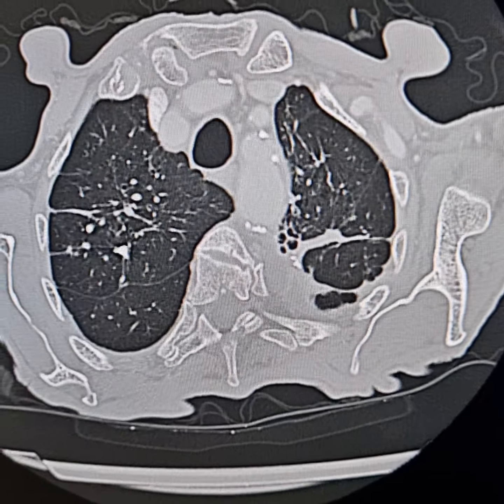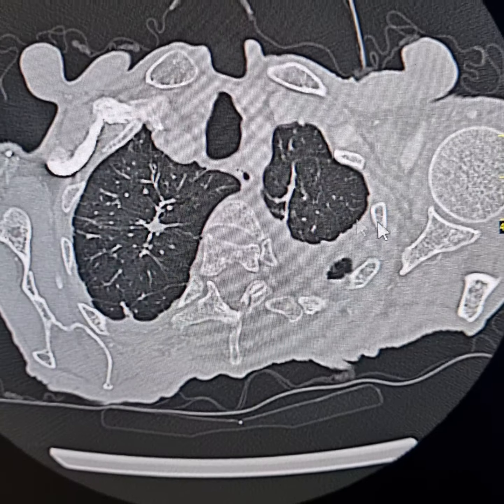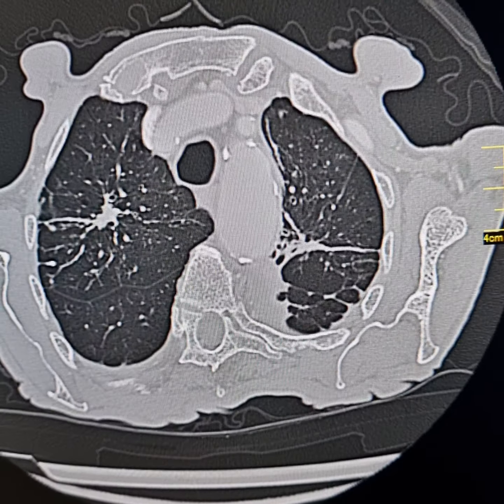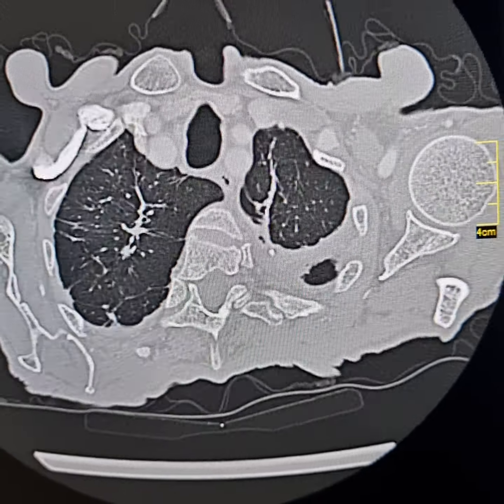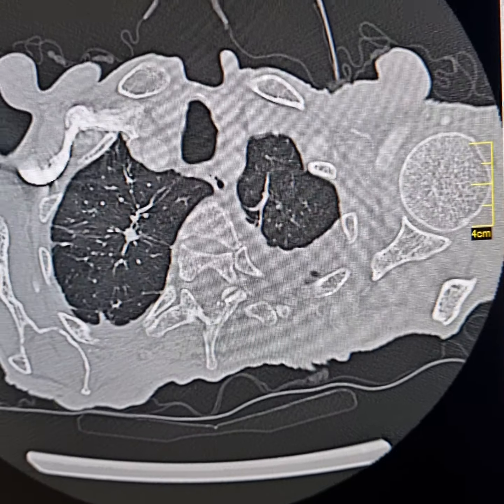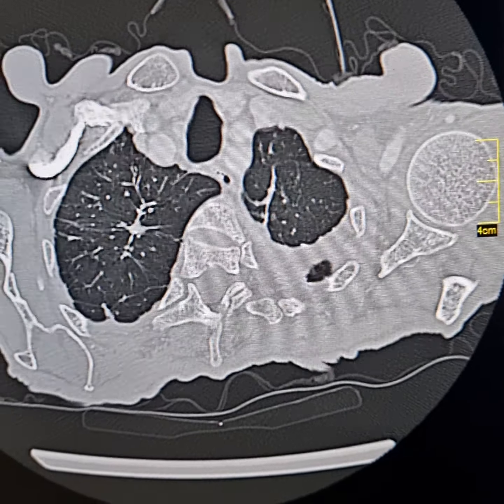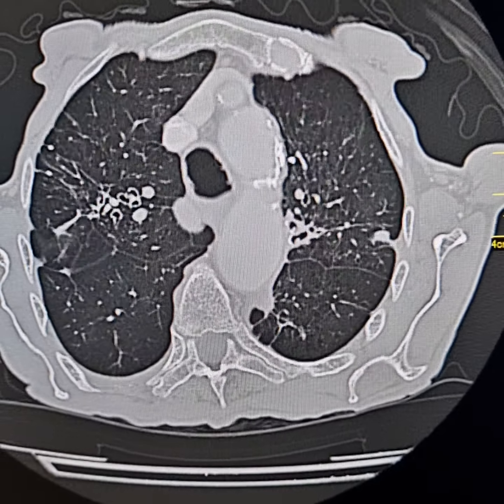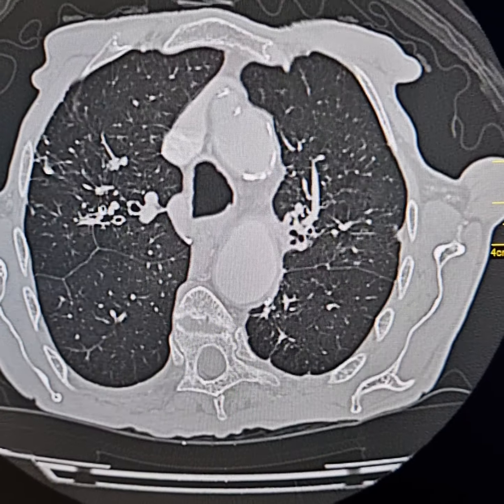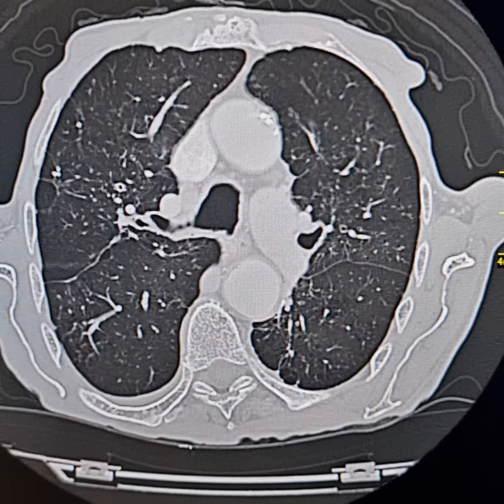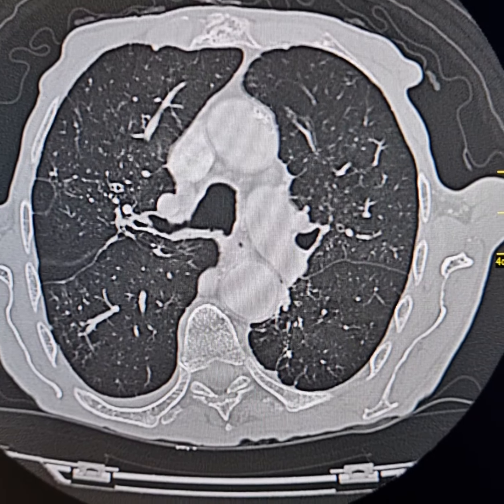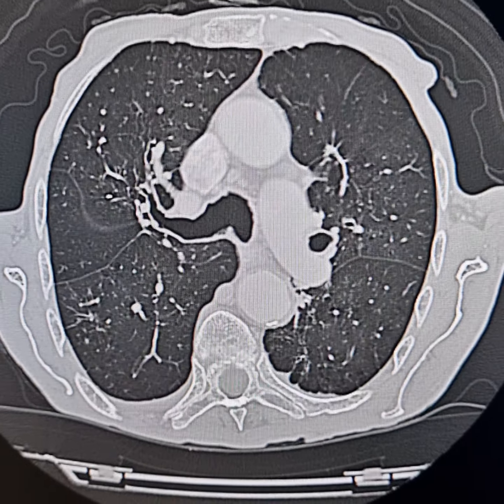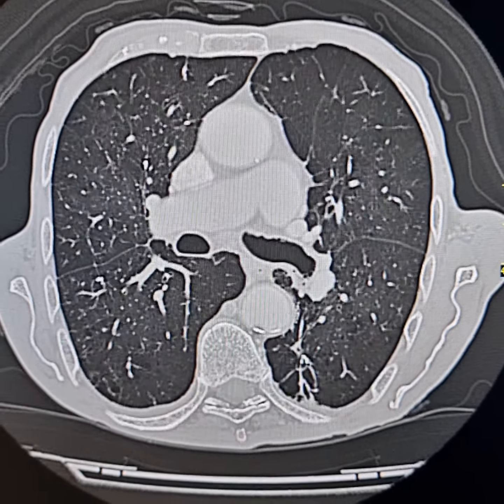Please observe typical findings of pulmonary tuberculosis in both lungs: areas of increased attenuation, nodular striated shadows, calcifications, bronchiectasis, and subtle emphysematous changes. The patient has been a smoker for almost 20 years, with a barrel-shaped chest.